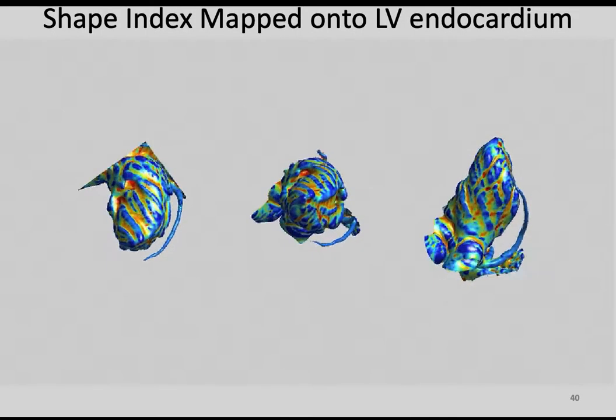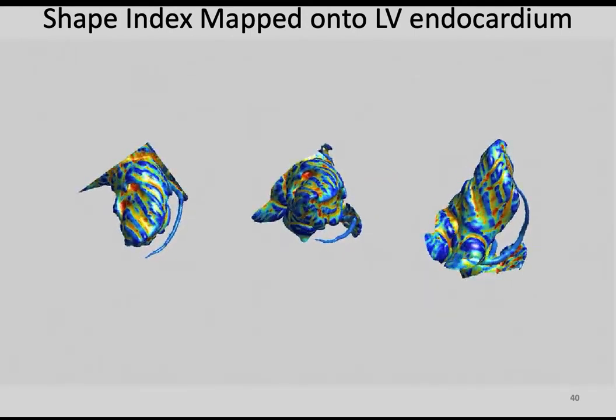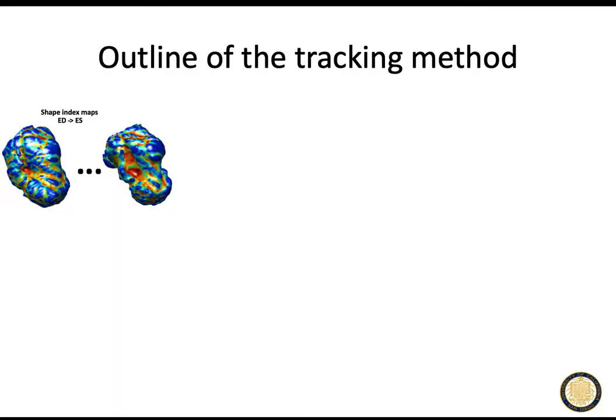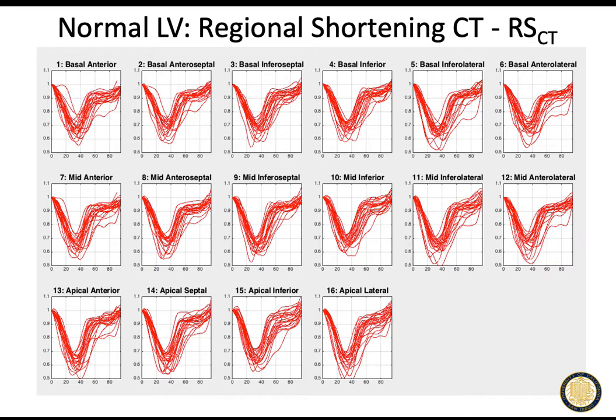So one of the things our lab and Dr. Elliott has done, Dr. Mayor's done, is to track that over time, and use it as a fiducial marker to tell whether something is deforming or not. So the idea here is that you can do some non-rigid registrations and tell, for example, this is the conformational shape of the heart at rest, and then as it contracts down, little pieces are contracting and turning blue, and there's an infarct here that is remaining yellow, and that area is not deforming down. So instead of visually looking at the infarcts, you can actually do it quantitatively.